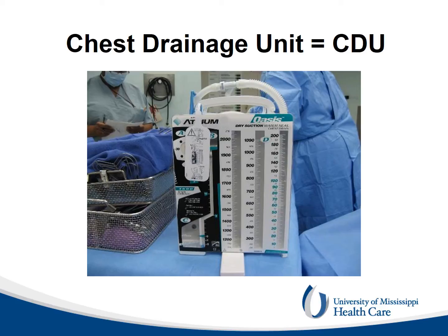The section on the far left has, on the bottom, the water-sealed chamber and, on the top, the suction regulator, here covered by an instruction plate, with its rotary dial on the left upper side of the CDU. On top of the CDU there is an automatic and a manual high negativity vent which release the high negative pressure and lower the column of water in the pleural pressure indicator chamber. A positive pressure protection valve is also present, which prevents the formation of a tension pneumothorax in case the suction system gets obstructed.